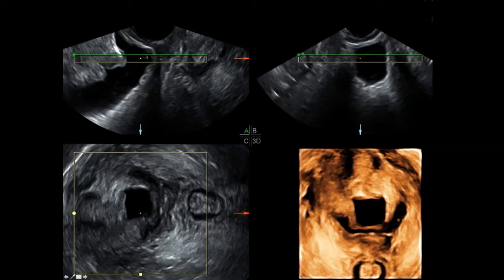Here the bladder is just about all the way out, and you can see that we can't even see the urethra. It's probably bent or perpendicular. It's actually probably perpendicular right here. I mean horizontal right here, and so this part of the bladder cannot be emptied. And the 3D shows you the part of the bladder that's in the vagina.